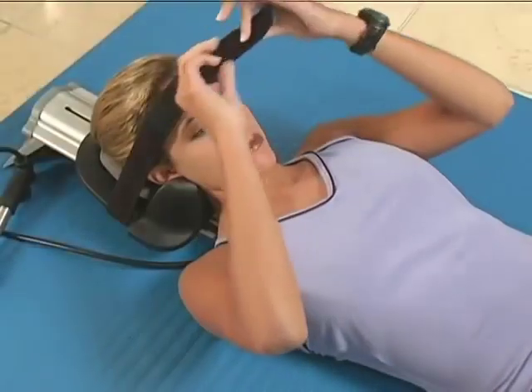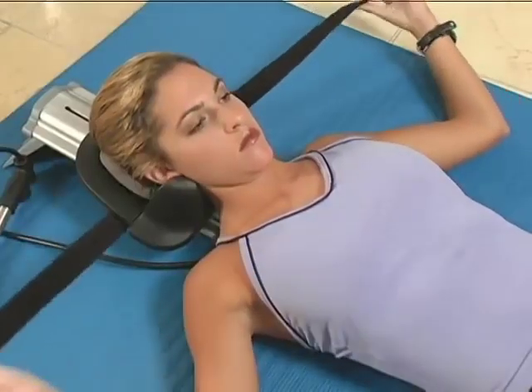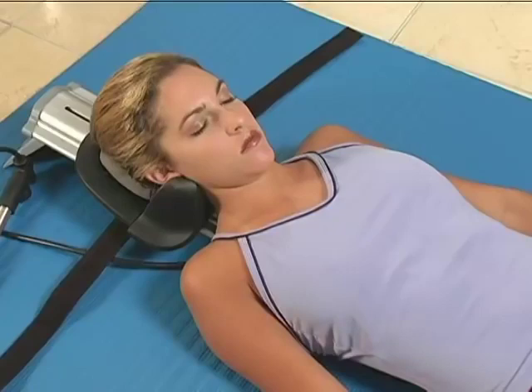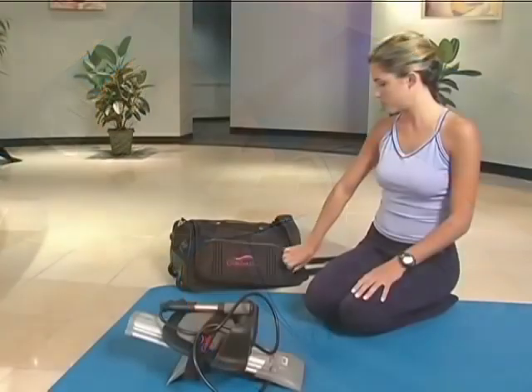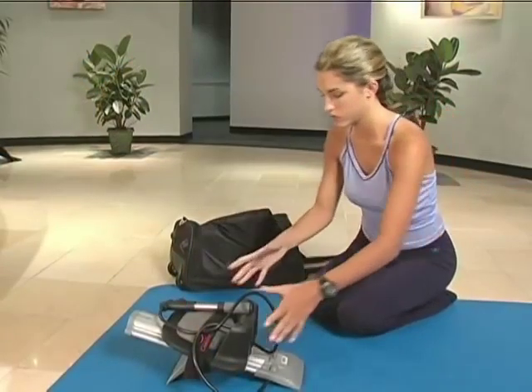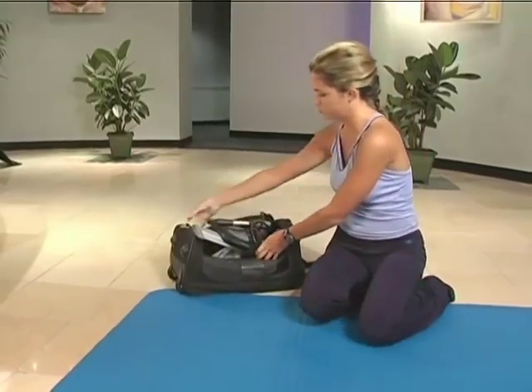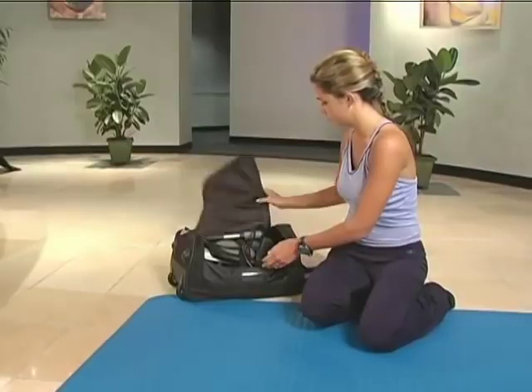Release the forehead strap and relax for a couple of minutes before removing your head from the ComforTrac device. You have now completed your treatment. Return the ComforTrac device to the custom bag. No disassembly is required.